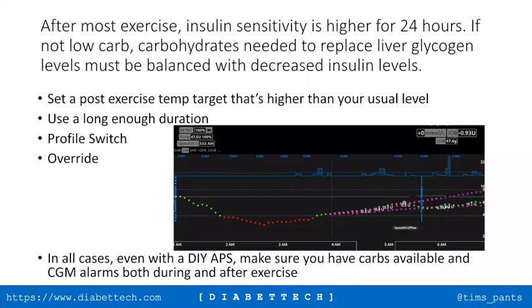I did try different variants, and the first thing I have to look at is, like David said, the IOB. I can't start doing exercise with IOB that is high. Too positive, yes. Yeah, zero, it's okay, but okay-ish.